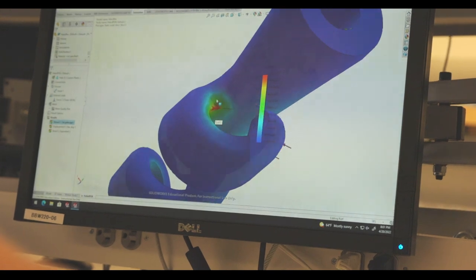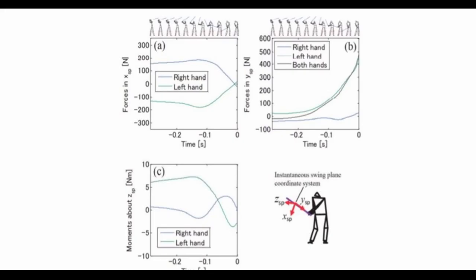We wanted to address this issue, and so we decided to run a SolidWorks finite element analysis. We were able to find some data from a study about the forces involved in the hand during a golf swing, and then we used those in our estimations with the simulation. Doing this, we were able to produce results that happened to match our physical testing almost directly. There were stress concentrations exactly where those tears occurred, which helped us to really figure out how we could address those issues and move forward towards a better Helix.